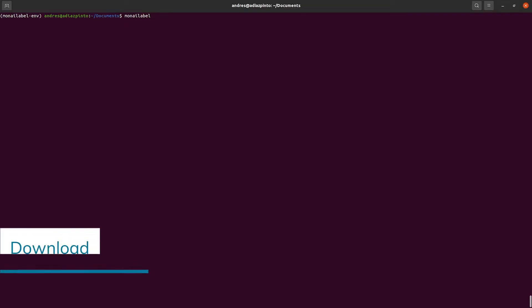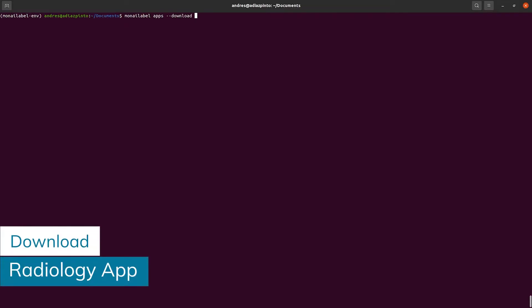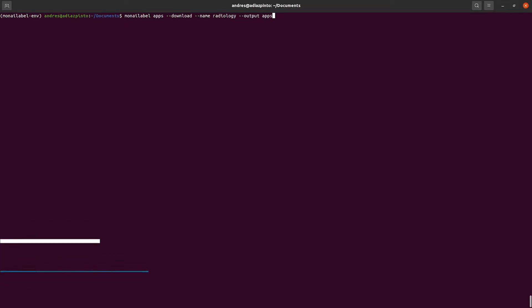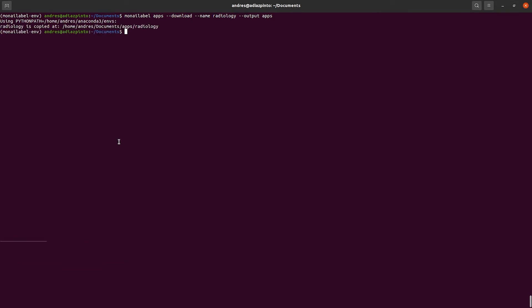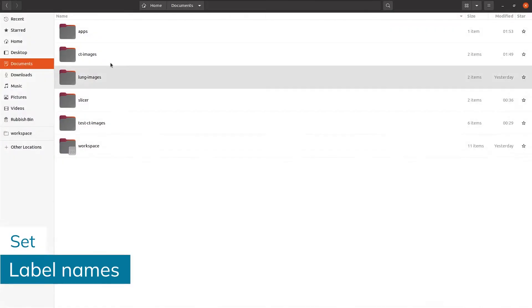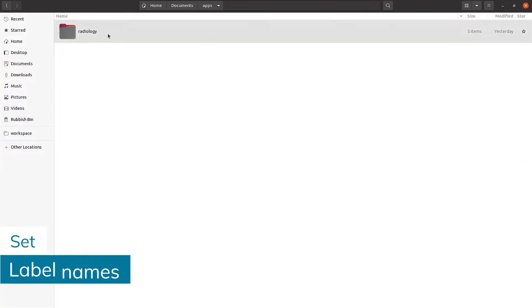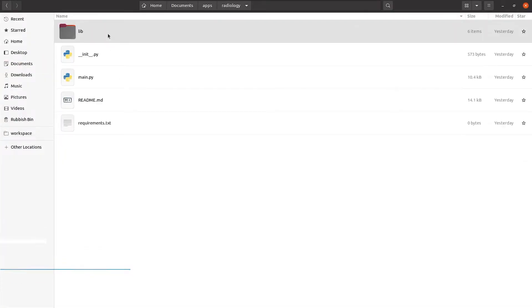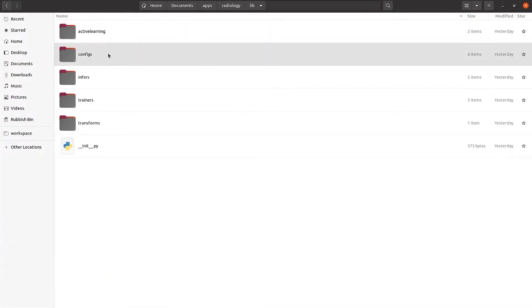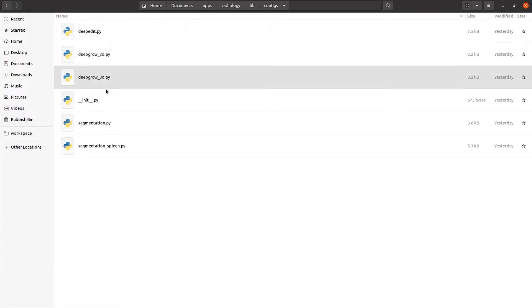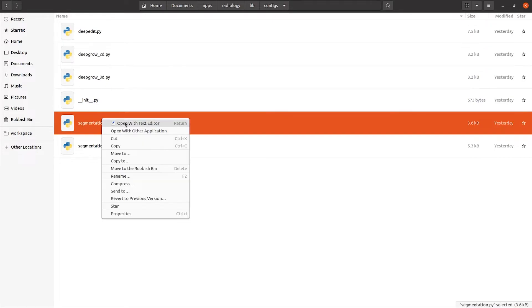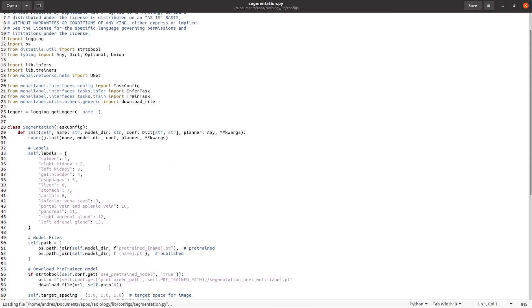As always, we first need to download the Radiology app. Once downloaded, the next step is to define the labels. For this, we set the label names in the config file of the segmentation module.